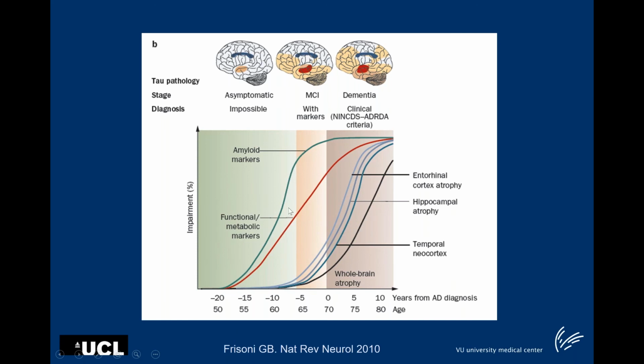So coming back to this cartoon with amyloid, we're on the very early side of it, and this is a very fortunate situation for studies like EPAD and AMYPAD, and also provides a window for secondary prevention. But in a clinical setting, it's too early. Let's say a patient comes in with memory complaints, you find a positive scan. Well, a positive scan could also be found in a healthy elderly. So the predictive value for Alzheimer's disease is not very high in the short run, whereas the atrophy is a bit late. So what we're constantly looking for are things that are slightly more in between, closer to what is called the disease onset.